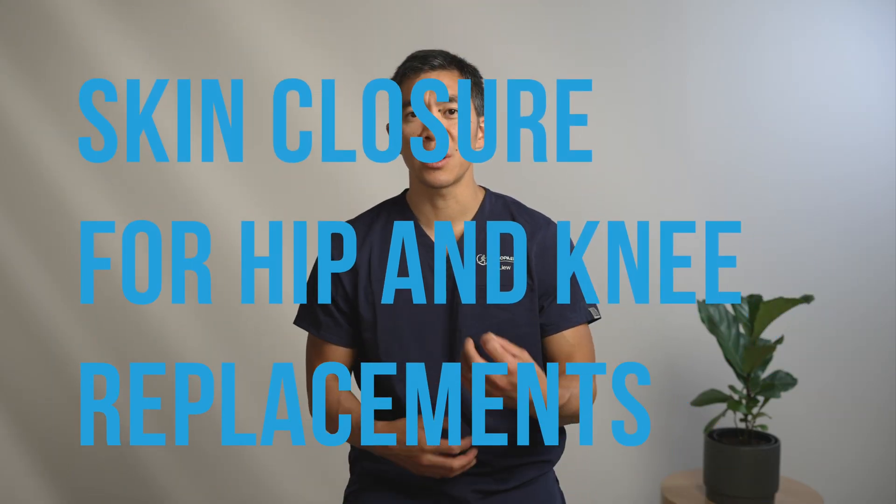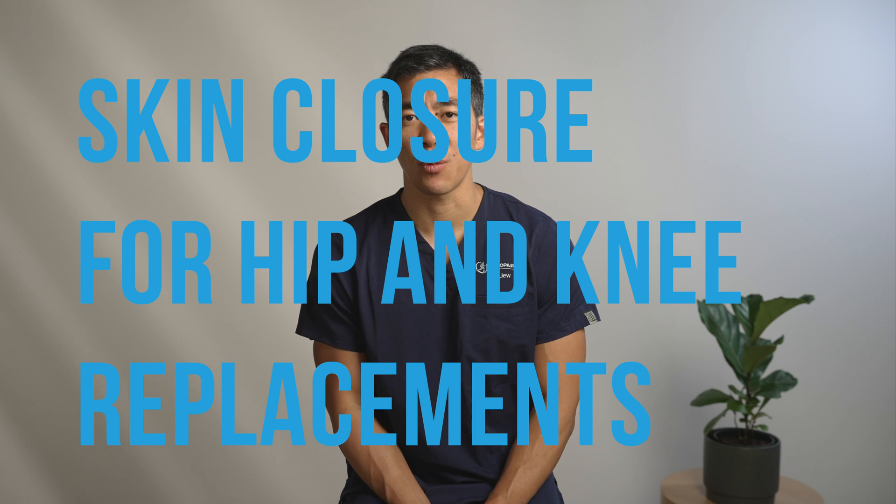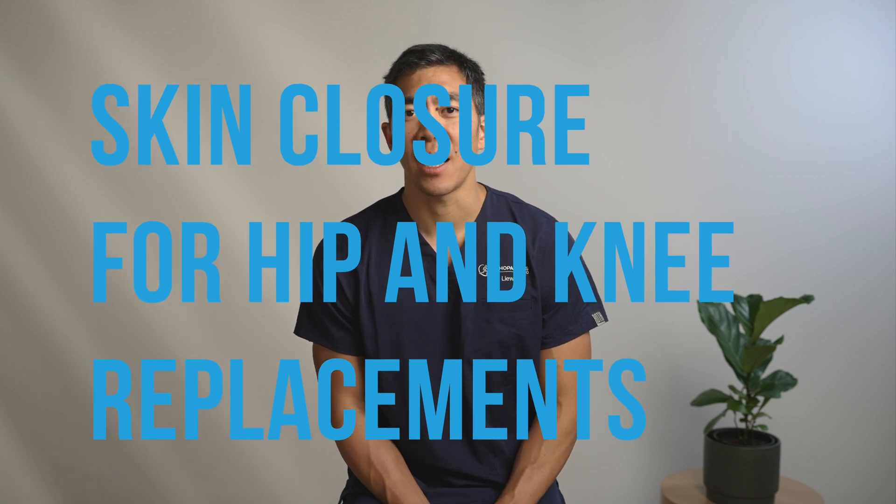Today I thought it would be good to go into some of the details about what the skin closure is and how it occurs. I only perform hip and knee replacements, so I certainly can't talk for other areas of the body where different suture materials and different closure methods are often used.